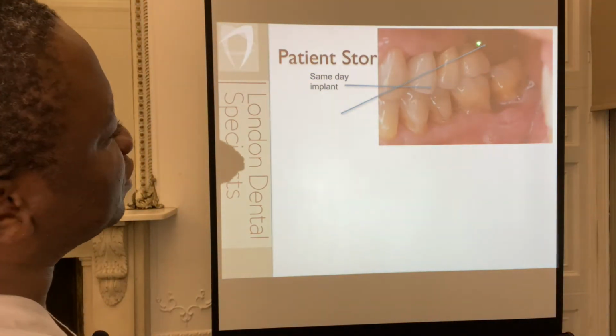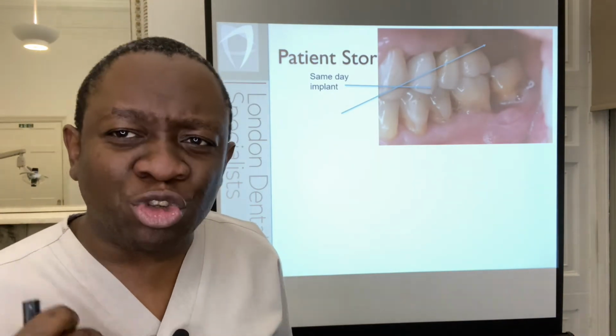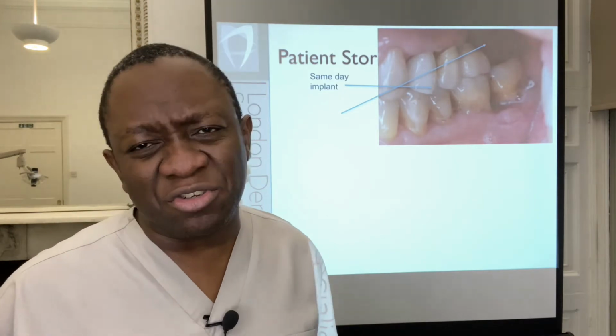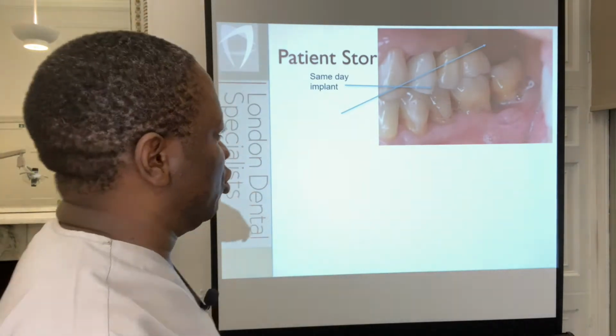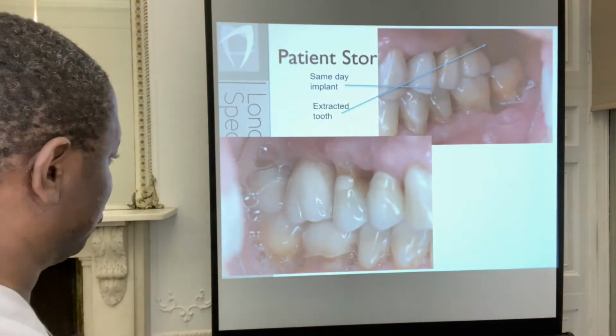This last tooth in the upper left unfortunately had too much bone loss associated with it, and there was no advantage to trying to do anything fancy to save it, so the patient agreed to have the tooth extracted as well.